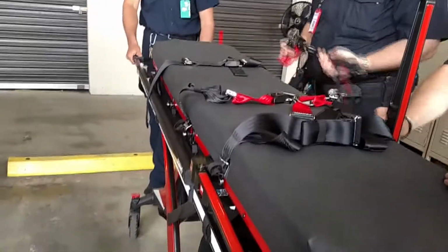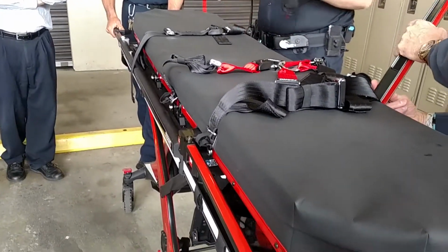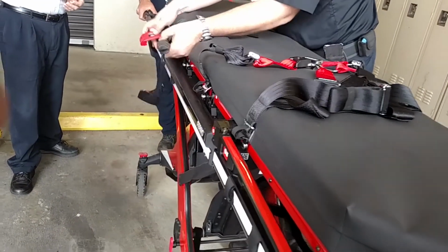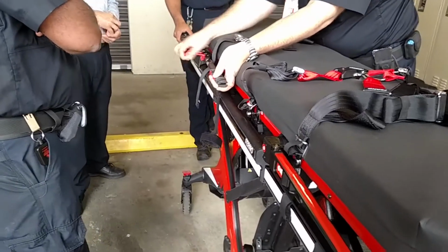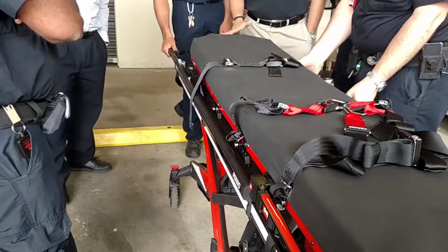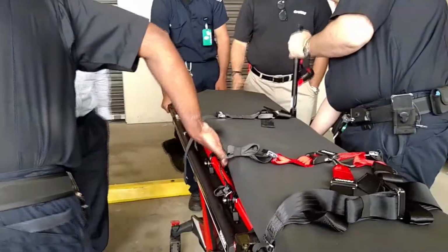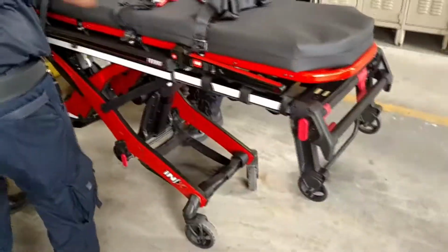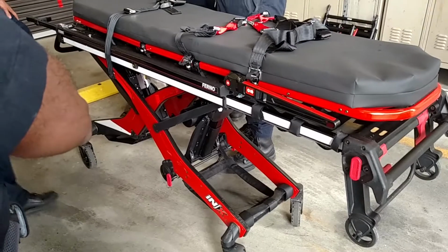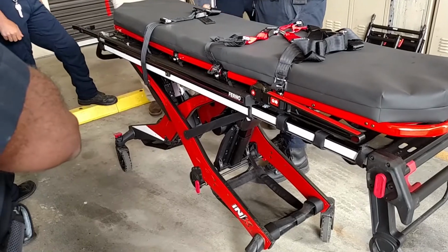There's a little button right here. Why is it yelling at me? Because you broke it. So what it's doing is it's telling you if I were a 700-pound patient, we're a little high to be rolling this thing across the ground. So what it's telling you is let's lower me down. It's going to turn white. Now for a 700-pound patient, this is the optimal, what we call the default transport height. If you were higher, say you're a taller responder, there's nothing that's going to prevent the cot from rolling. It's just a visual audible cue to tell you that I'm a little bit high. Oh, cool. You can adjust this different parts? Yeah, you can take that off and move it around if you want.